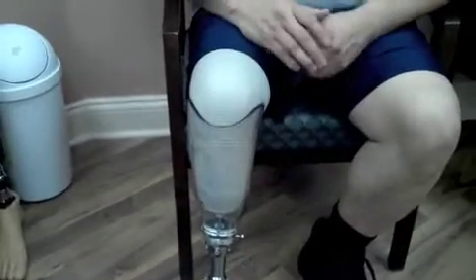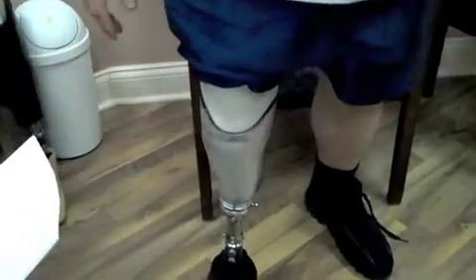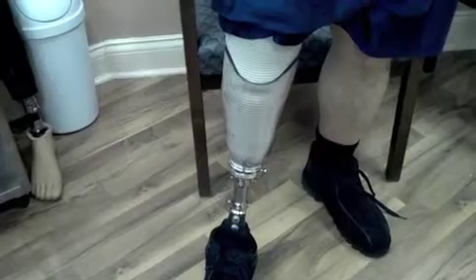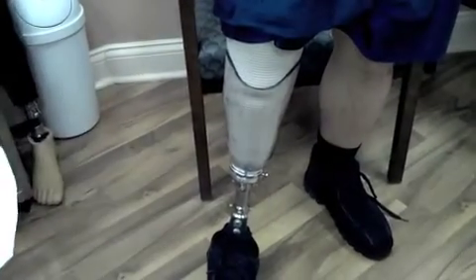Or by standing up and shifting weight. It should be moderately difficult to achieve 2 to 3 clicks. Difficult can be defined as a nice, tight-fitting prosthesis.